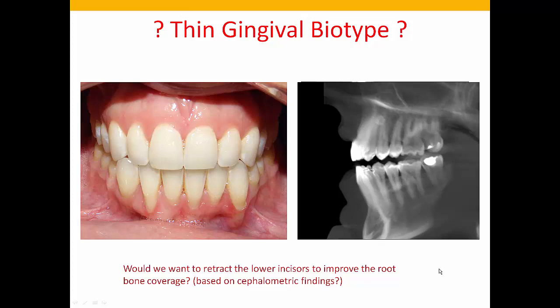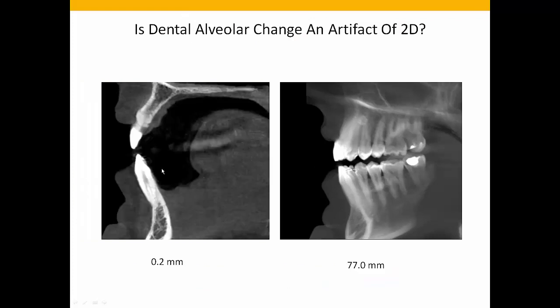It probably was not a good idea, because if you think about it, you get an adaptive resorption of the lingual bone, and this is the same patient you just saw. There's really no place to reposition that tooth. The lingual bone adapts to the root of the tooth. So to try to move the tooth back lingually over thicker bone based on this two-dimensional radiograph is probably not the greatest idea. Because where are you going to move that tooth? Where it's in better bone? You can't.